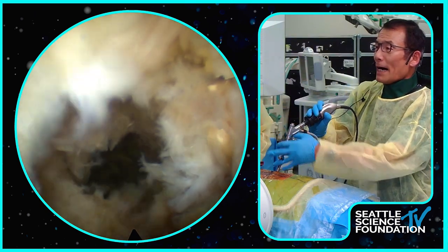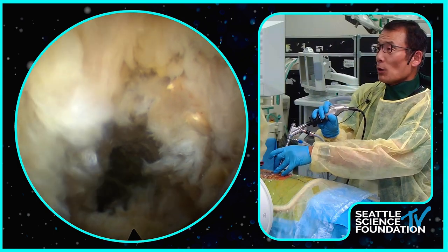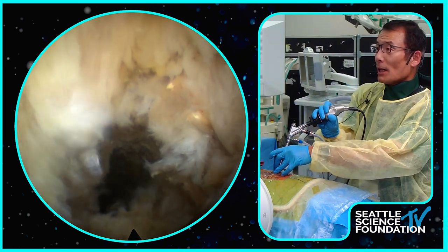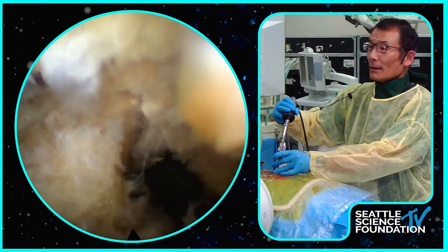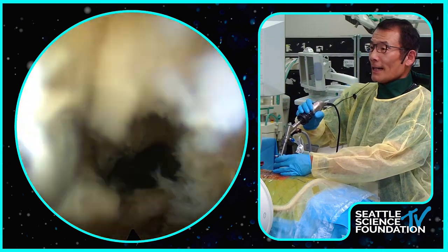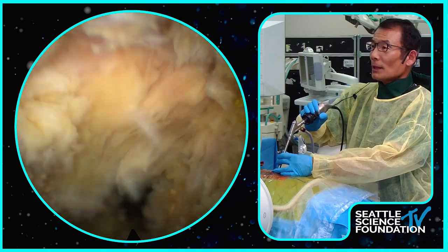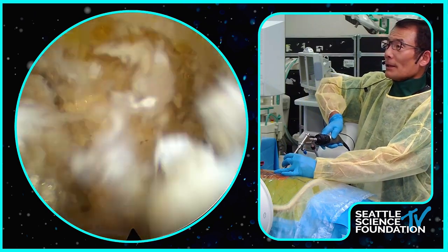But for L4-5, like here, if you want to work your way lateral, you see that's your exiting nerve, okay? And this is your traversing nerve. This is your Kambin's triangle. It's already after discectomy. If I go to the contralateral side, I already did my decompression. Let me show you.